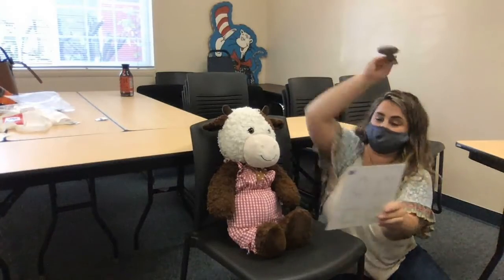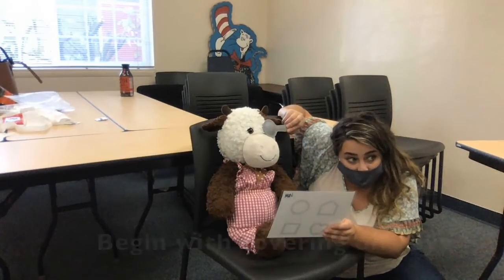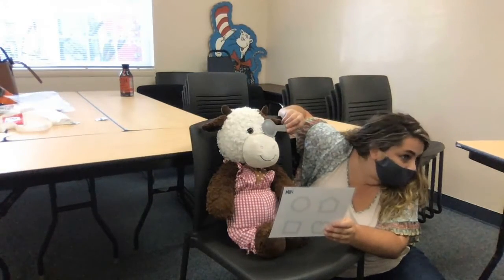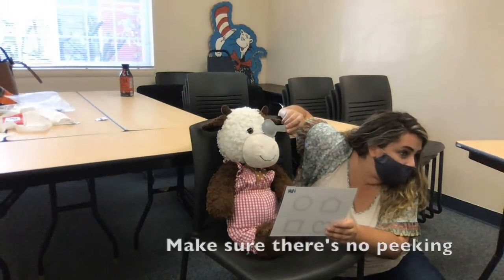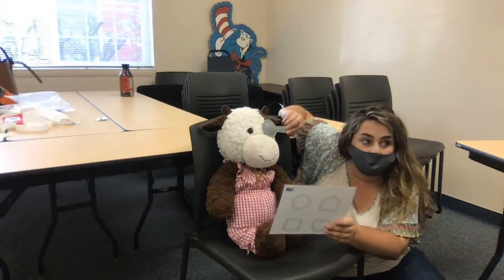Start screen by covering one eye. The child may choose to verbally respond with the previous shapes discussed, or they may point to the response card. Both options are acceptable.